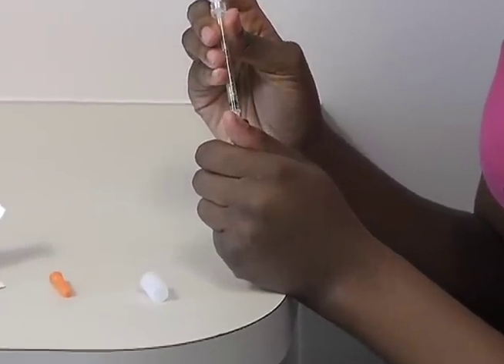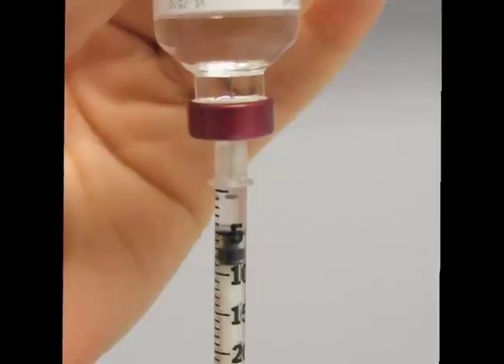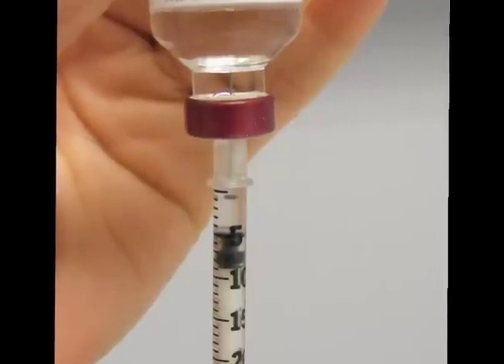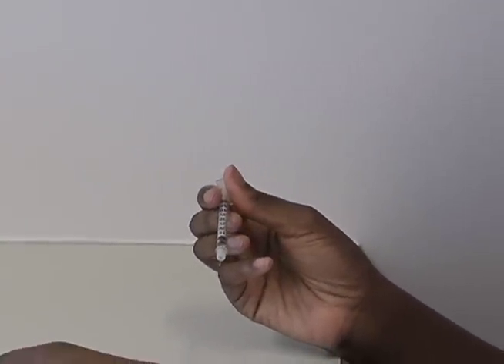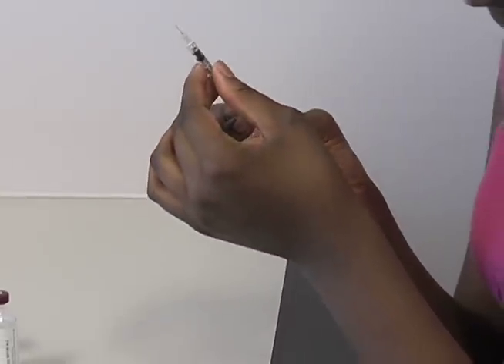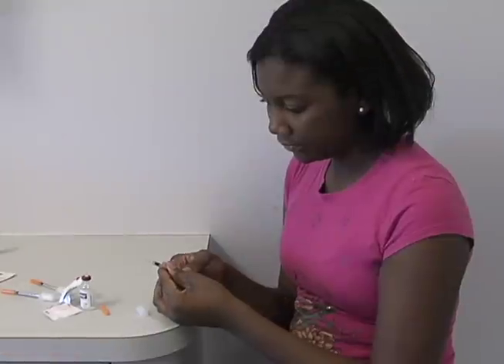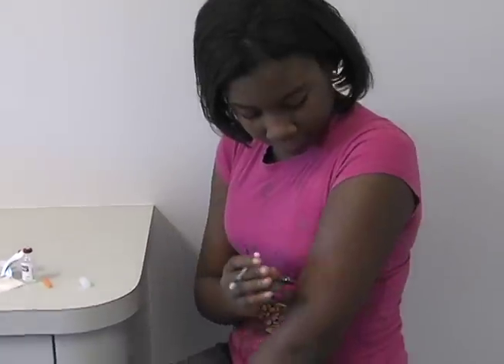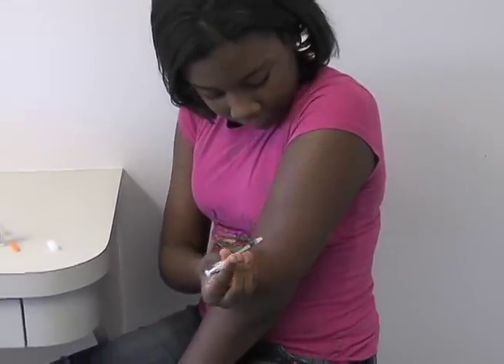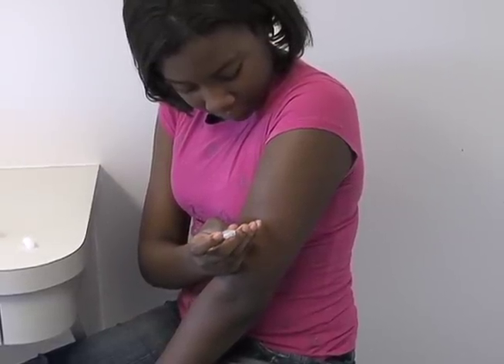Draw up that amount of insulin into the barrel of the syringe. Inspect the syringe for air bubbles. It may be necessary to push insulin back into the vial and slowly pull insulin into the syringe again, observing for air bubbles each time. Air bubbles are not harmful if injected, but bubbles make the dose of insulin given smaller than it should be. Make sure the injection site is clean.